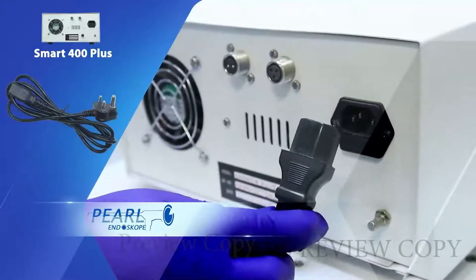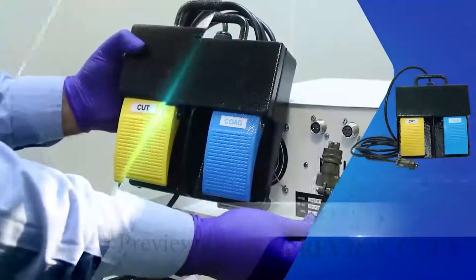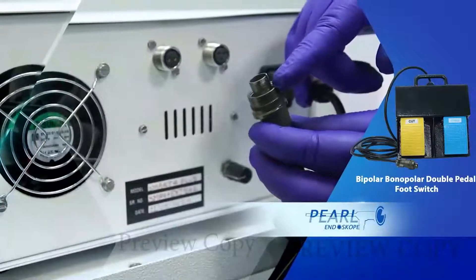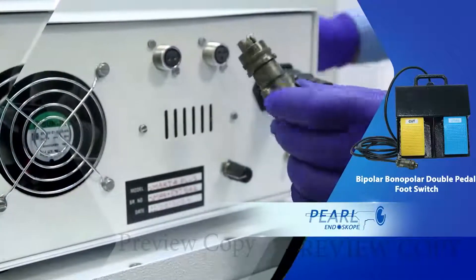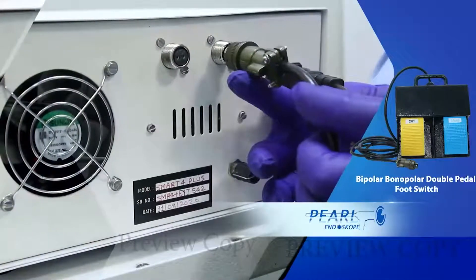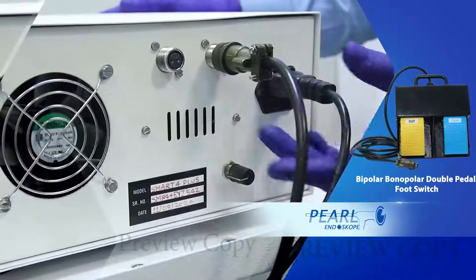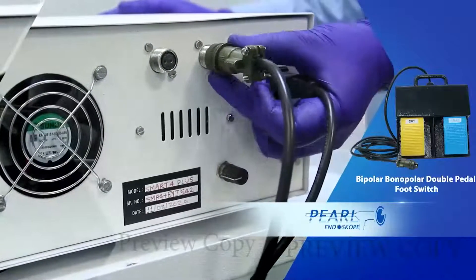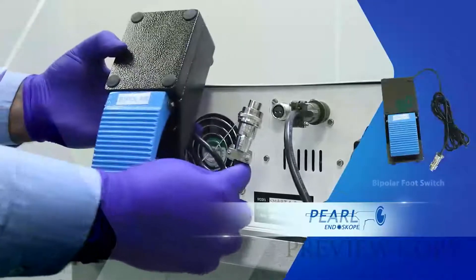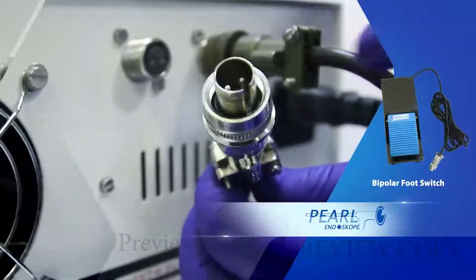The power cable is connected to the machine. This is a monopolar foot switch; the three-pin cable is connected to the machine with the notch upwards, then slightly rotated to secure the cable. The two-pin bipolar cable is also connected to the machine with the notch upwards.